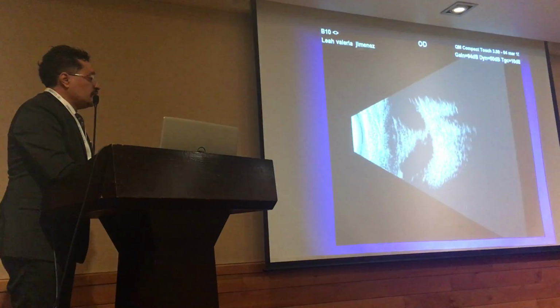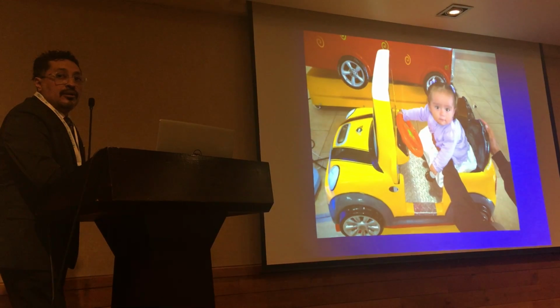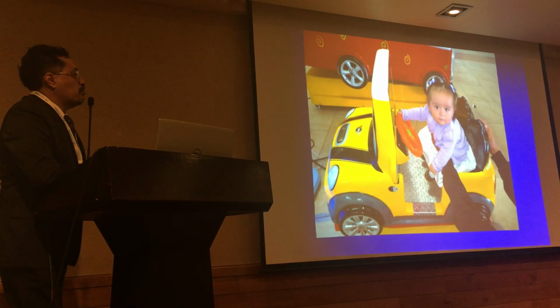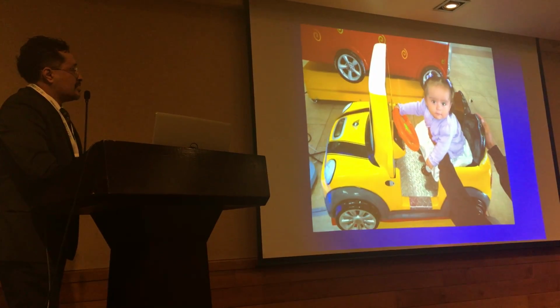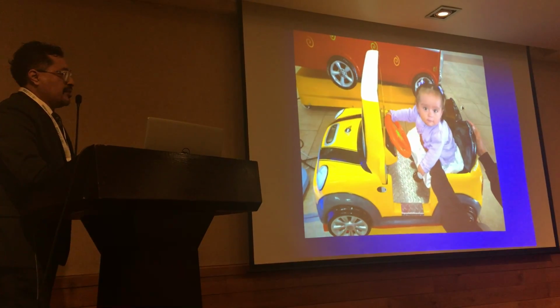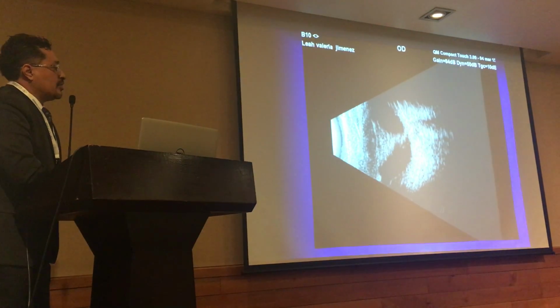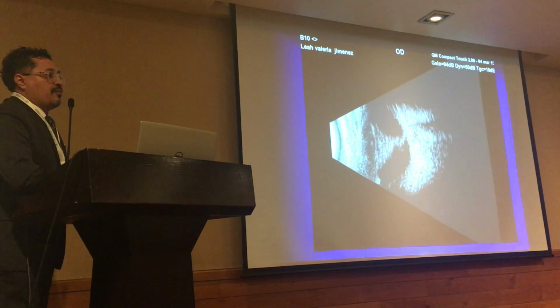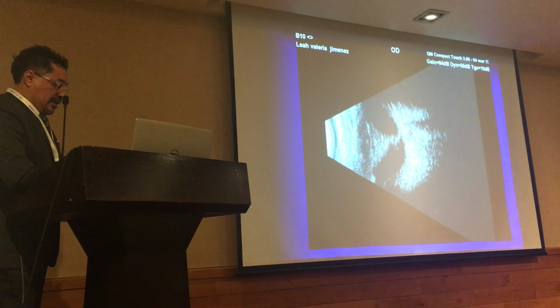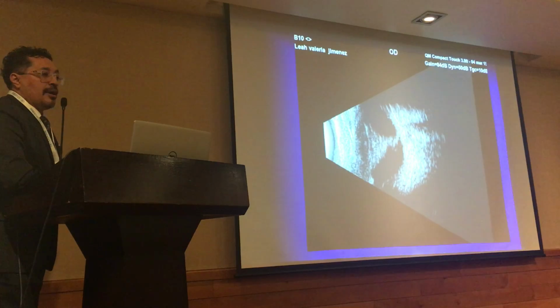But what is the main reason I made this study? This is the main reason. The patient who made me begin this work is Leah Valeria. I made the scan maybe 6 or 7 years ago, and we saw this image. I don't know if any of you have a guess about the result. I think it's very conclusive that it's a retinal detachment. We don't have any doubt.